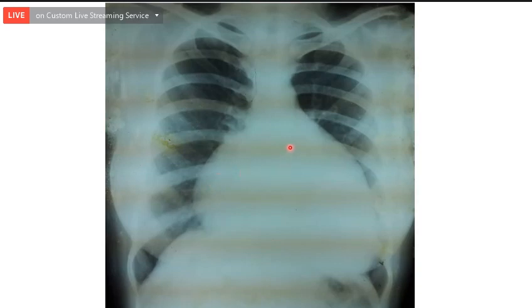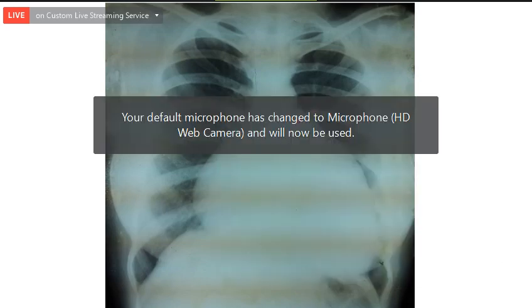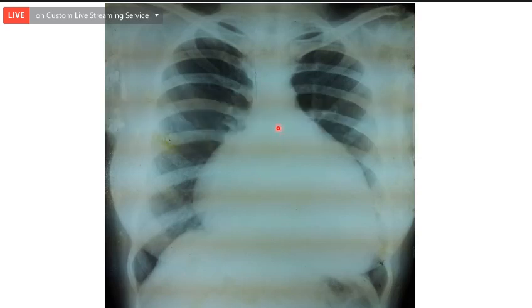The apex, difficult to say, maybe. And sir, pulmonary plethora is not there. It's normal pulmonary vasculature. Actually, the pulmonary vasculature is normal. Very insignificant, actually. You are seeing only very, very small vessels. And narrow pedicle, very good. And what is this? RV outflow tract, sir. It's already dilated RV outflow.